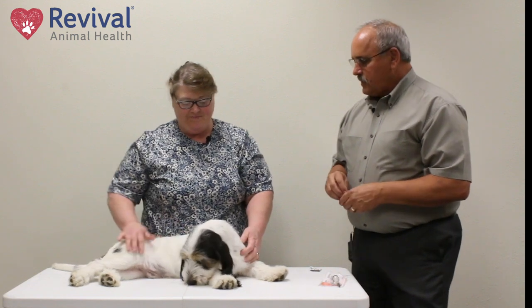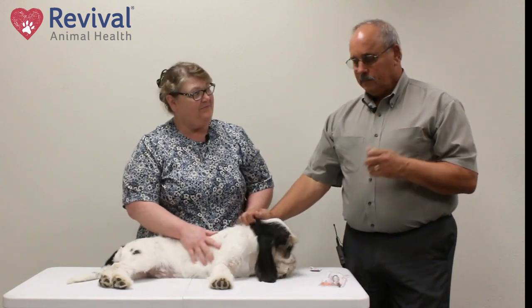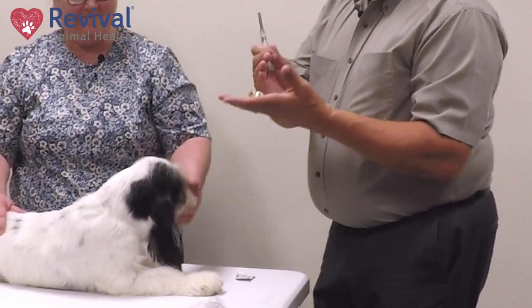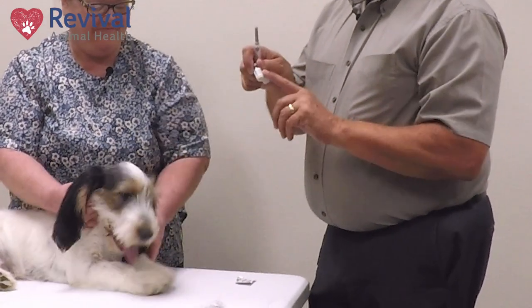When we're doing injectable vaccines, what we're actually doing is giving them a wimpy strain of the disease to try to stimulate immunity into the animal or the human before we actually see the wild virus or the disease. We have the vaccine, the sterile diluent, and then the powder — that's where the virus is. It keeps it stable until we hydrate it.